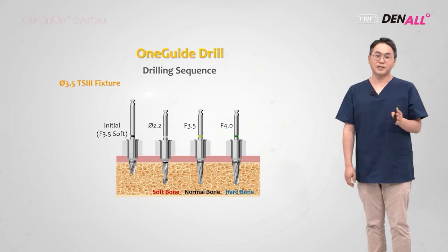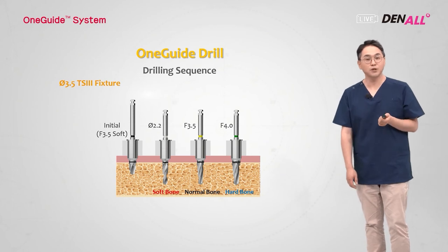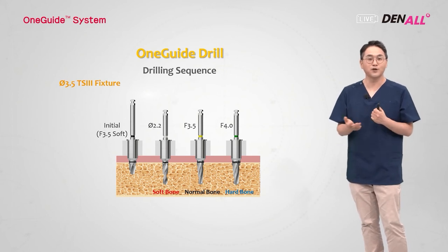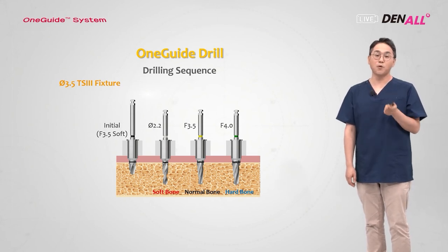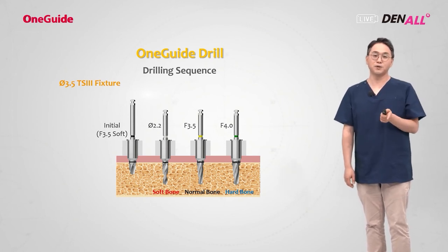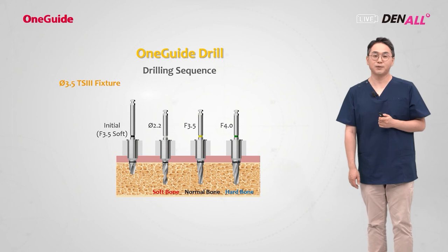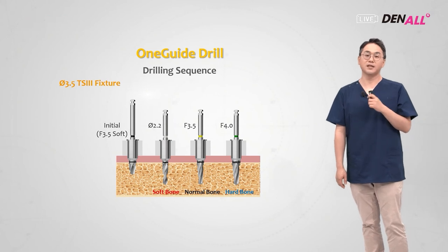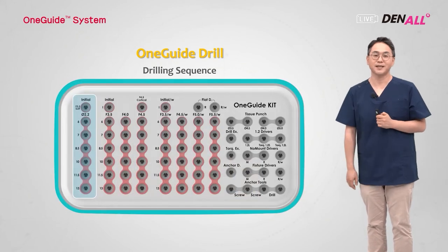When you use one guide kit in soft bone, you need to one size under drill, and in hard bone, one size over drill. To place a 3.5 implant in normal bone, initial and 3.5 drills can be used, but how would you under drill in soft bone? Because the 3.5 millimeter diameter drill is the smallest one, for such case, a 2.2 millimeter drill is included. In soft bone, after initial drill, a 2.2 straight drill is used before placing the 3.5 implant immediately. In hard bone, F3.5 and 4.0 one guided drills are used before placing the 3.5 implant, and you will get sufficient stability. Don't be too much worried about the numbers.